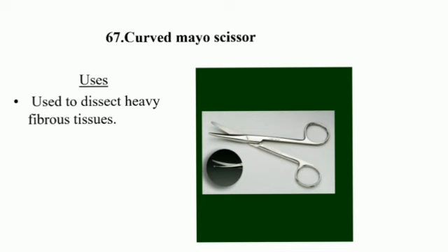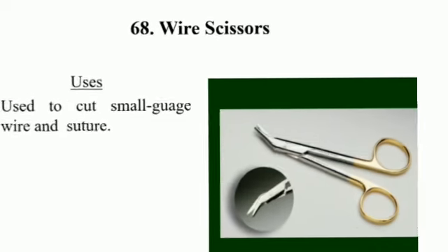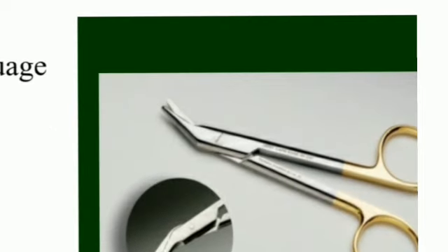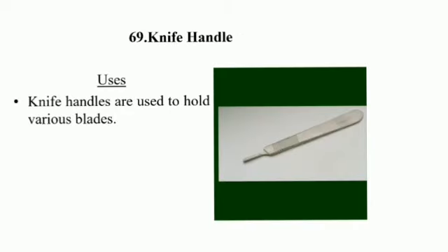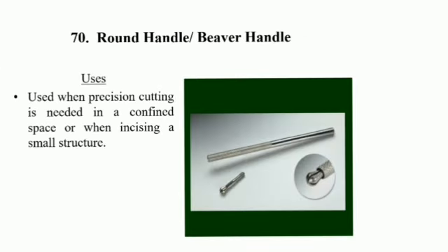Curved Mayo Scissor: used to dissect heavy fibrous tissue. Straight scissor uses: used to cut small gauze and suture. Knife handles: knife handles are used to hold various blades. This is the No. 3 knife handle.